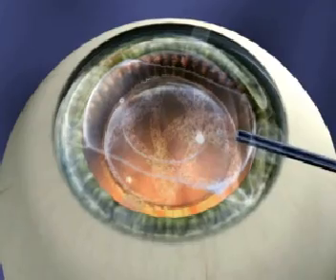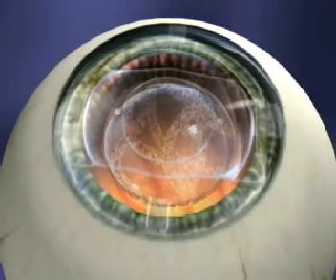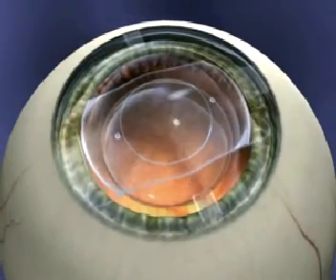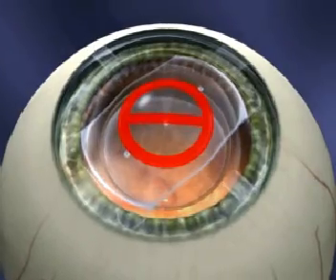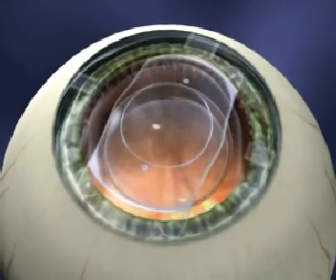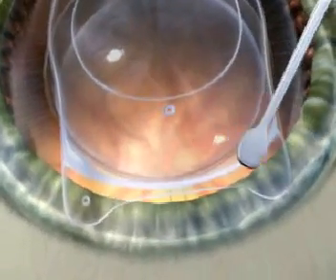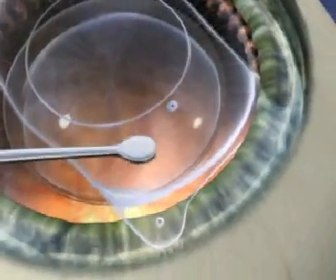Once the ICL has unfolded, inject additional viscoelastic on top of the lens to give yourself more room. Never inject viscoelastic underneath the lens. Now the ICL must be repositioned posterior to the iris plane via the paracentesis using the ICL manipulation instrument. Keep in mind that the central six millimeters of the ICL is considered the no-touch zone. Avoid going across the visual axis. Manipulate on the peripheral area, never on the optic.